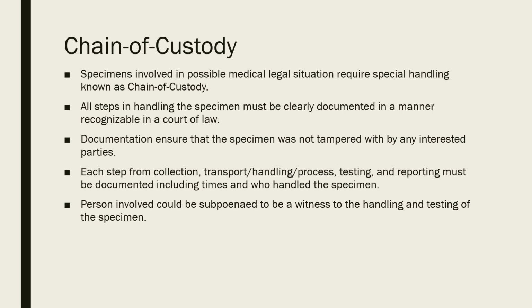And there are some specimens that occasionally have to go through a chain of custody. So anything that goes through a chain of custody is usually because it could potentially result in some sort of medical legal issue. You see this a lot with drug screens. So your drugs of abuse have to go through some sort of chain of custody.